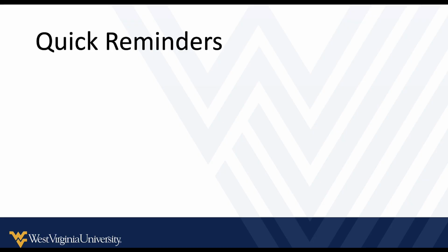So just some quick reminders about the FAST exam. Like a lot of point-of-care ultrasound, the FAST exam is something that adds to your history and physical. It doesn't replace CT scan. It doesn't replace your brain. It doesn't replace other necessary imaging if you need it, but it gives you quick, repeatable information at the bedside that can sometimes lead to life-altering decisions.